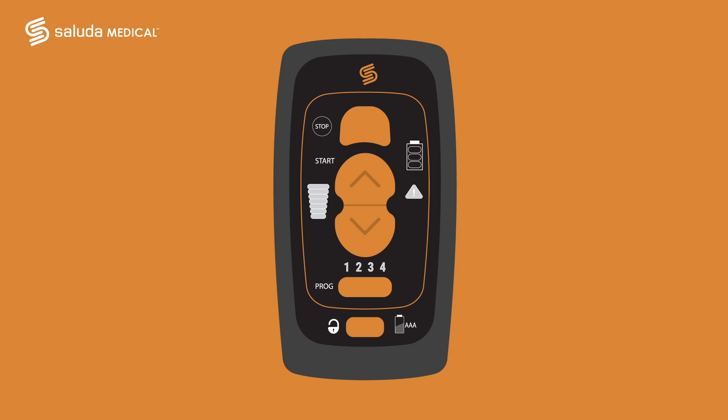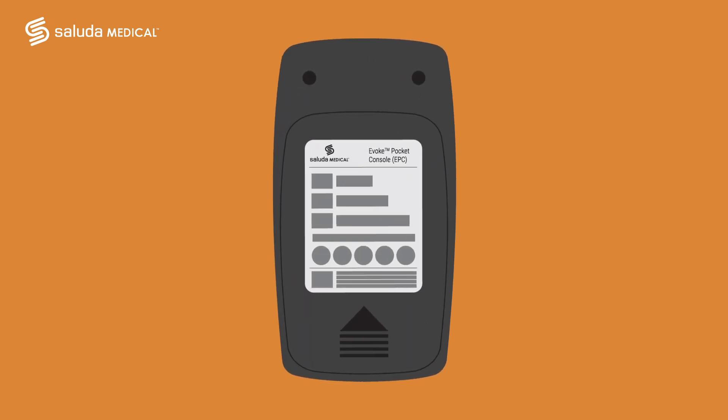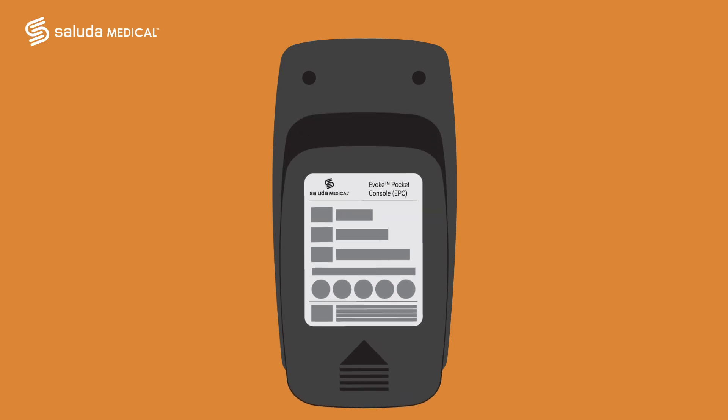An orange bar will indicate that you should charge your stimulator. The last symbol we will look at is the low battery indicator for the remote itself. The icon is located on the bottom right of your remote and will tell you the battery level of your remote. This symbol will be lit orange when you need to change the batteries in your remote.